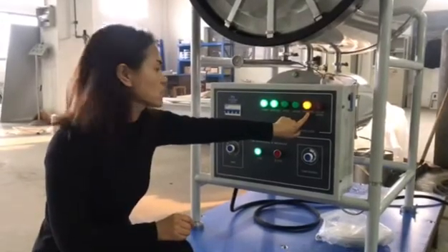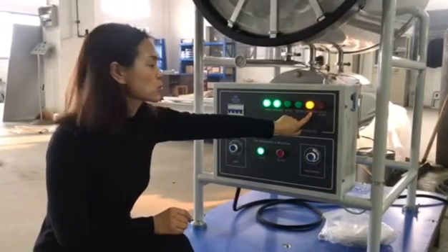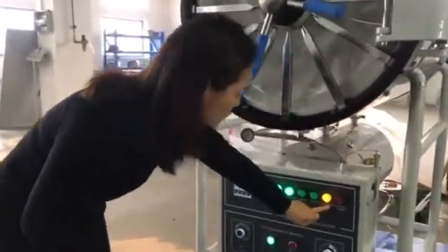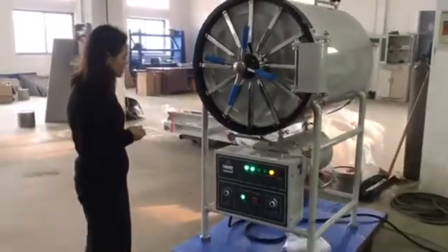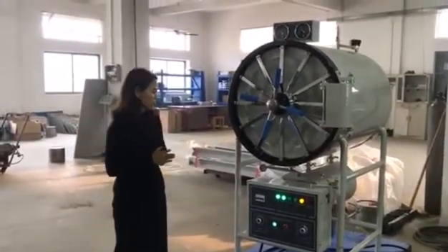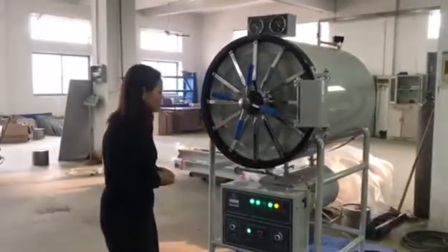Normally, the sterilizing process also takes around 20 to 30 minutes. After the sterilizing process is finished, there will be an alarm. Then it will remind the nurse that the sterilizing is finished.